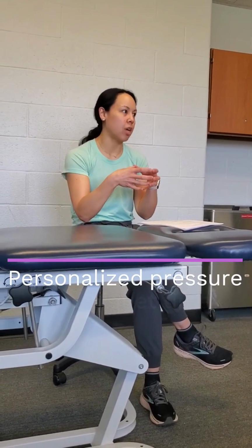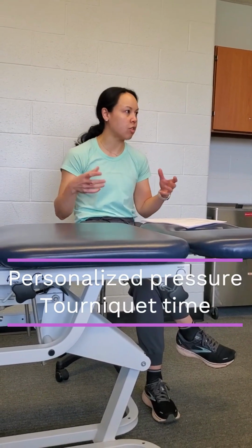So how long was the patient actually on the tourniquet versus in a rest phase between exercises when it's deflated. You could be super specific and say the tourniquet time was 6 minutes for this exercise, and then you deflated, and then it was another 6 minutes for the second exercise, right? That's probably how I'm going to document it, just so I can keep track of what the patient's doing and which exercises they're doing.